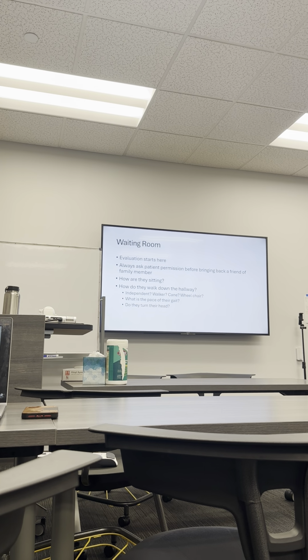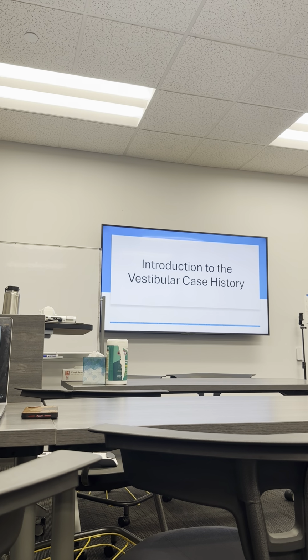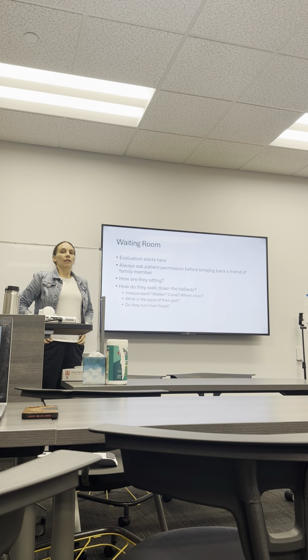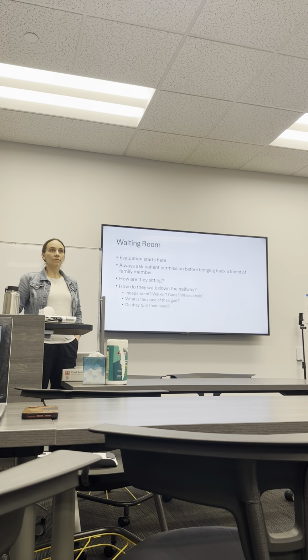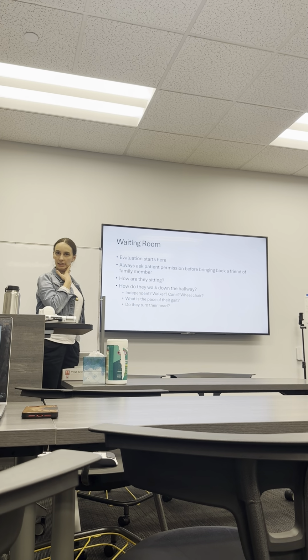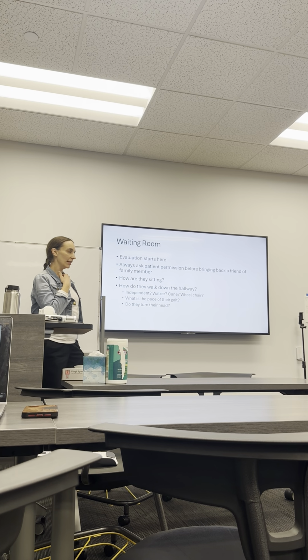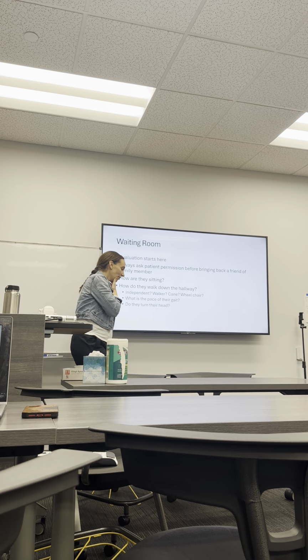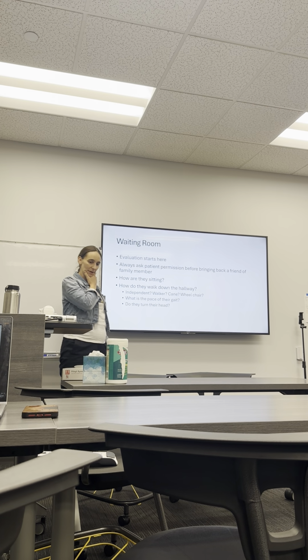Yes? Going specifically back to standing up, if you see that they might not have the core strength, if you're going to do something like cVEMPs, are you thinking, okay, maybe we need to do a different setup from the typical supine head up? You can consider doing a different setup, or you can have them sit upright and then turn their head in order to accommodate it. Some patients may not move their head because they don't have cervical function. They don't have a safe cervical spine to do that type of head movement. So always ask about that.